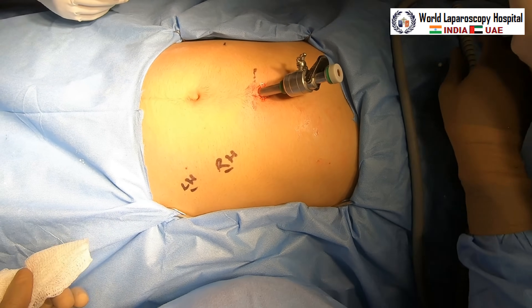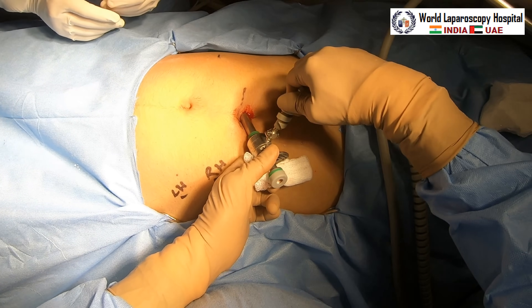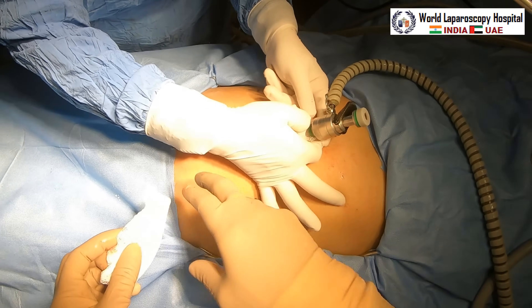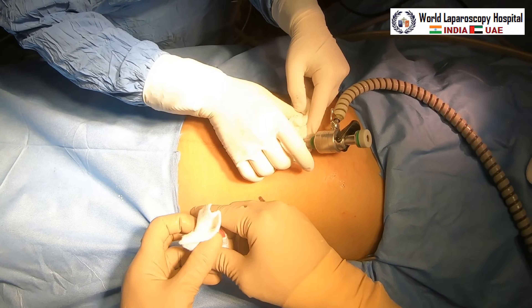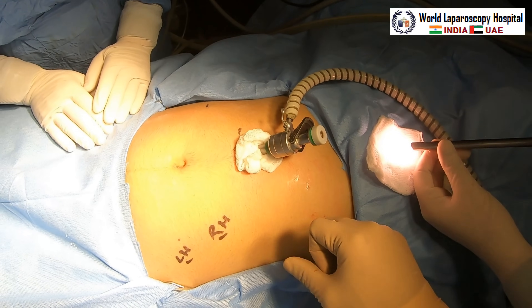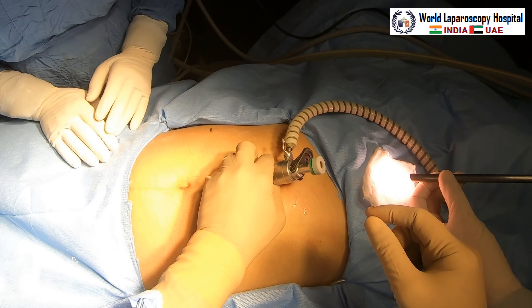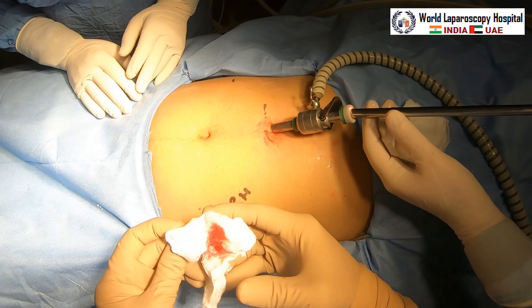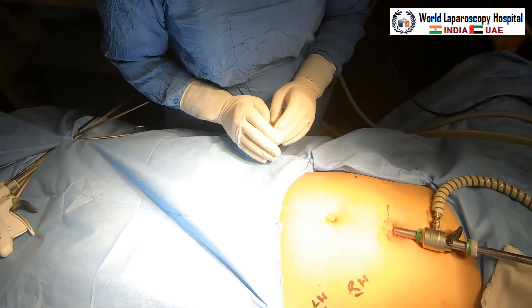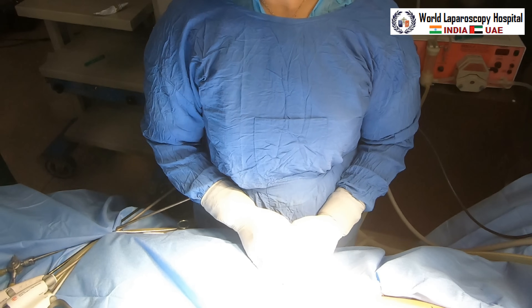By the time the telescope is placed, your assistant will do white balancing and focusing. The insufflator tubing should be re-attached and flow rate can be increased to 10 liters per minute. In cases of ectopic pregnancy requiring irrigation and suction, you may increase the flow rate further. White balancing and focusing at a distance of 10 centimeters is done. Now the telescope is inside and you can do the initial diagnostic laparoscopy.